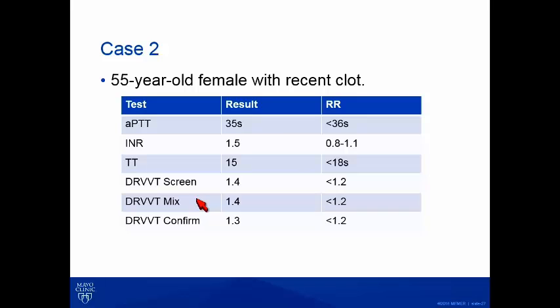So this could be a number of things. It could be a lupus anticoagulant. That would be reasonable, but as this step would tell us, we need to rule out other causes. And so another pattern that this could reflect is actually the effects of warfarin and a false positive result in warfarin, sure. But at my institution, this is how I typically see the direct 10A inhibitors behave. And this might not be how they behave at your institution, but after seeing a lot of these, this sort of got my spidey senses tingling that there might be something going on. And so, in fact, an anti-10A level done in this patient was consistent with circulating direct 10A inhibitor, and a phone call also showed that the patient was on rivaroxaban at the time of testing.